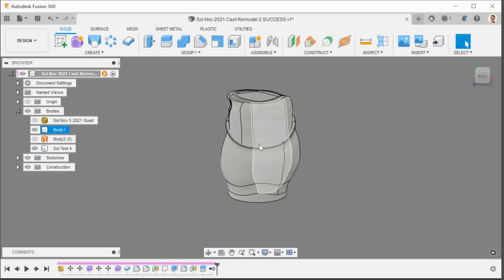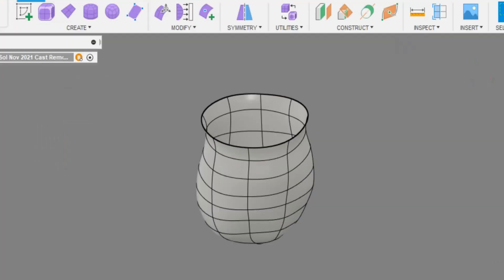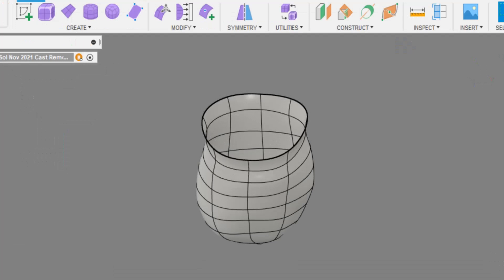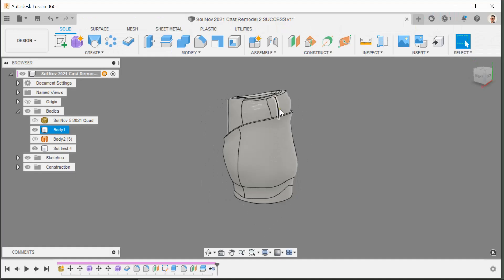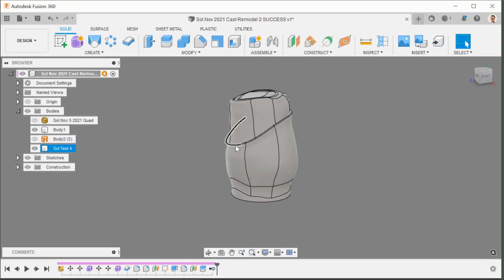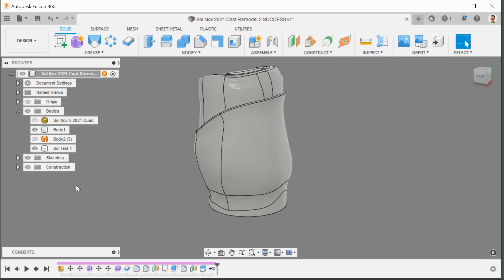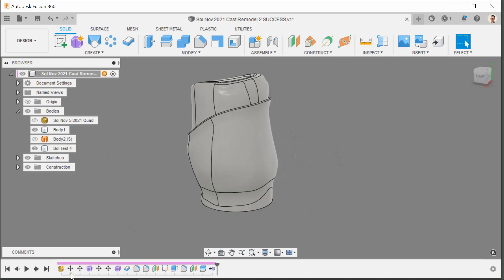I've lowered the neckline trim line slightly — there's a 2 millimeter drop at the back and an 8 millimeter drop at the front, which is quite noticeable. But Sol says it's very comfy. The only part I'm working on today is at the back.